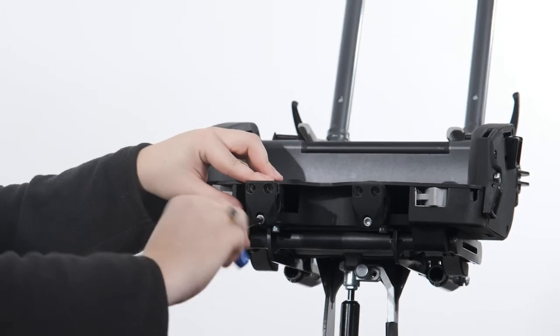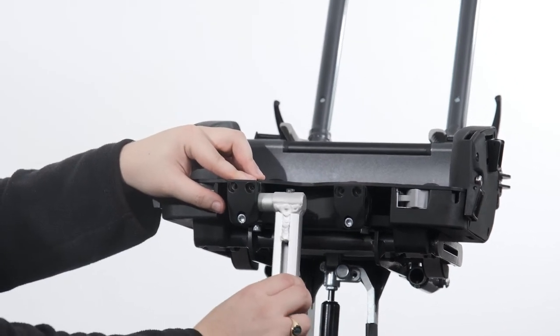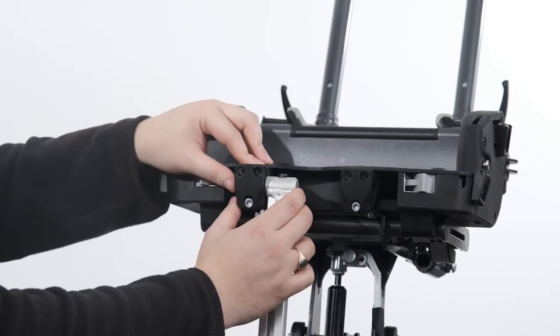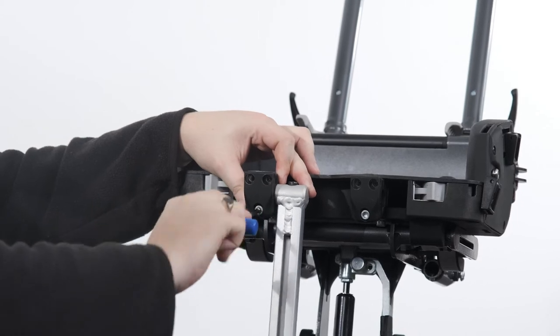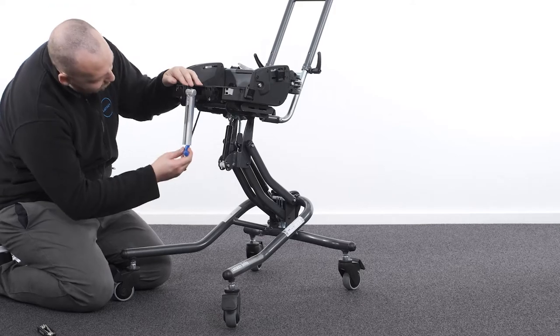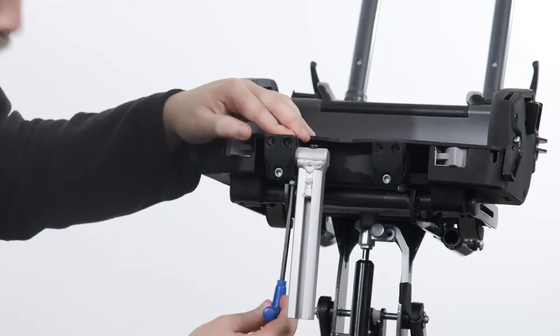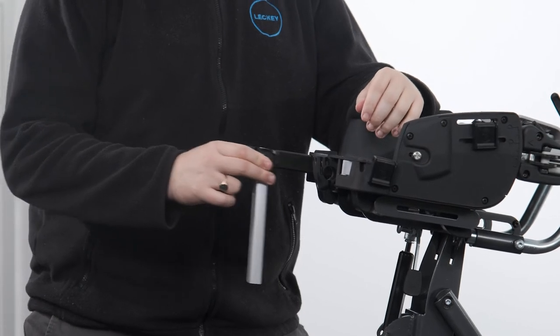Attaching the leg stem. Before attaching the upper leg stem, ensure the clamp is loosened. Then slot the round boss of the upper leg stem into the clamp from the inside face and re-tighten the clamp using the Allen key. It may be required to adjust the position of the femoral bar to allow for the upper leg clamp to be inserted. To do this, loosen the bolt on the underside of the seat base and move to a suitable position.